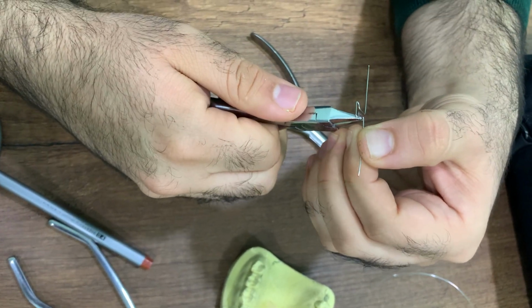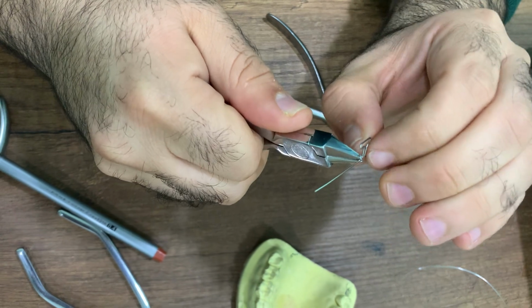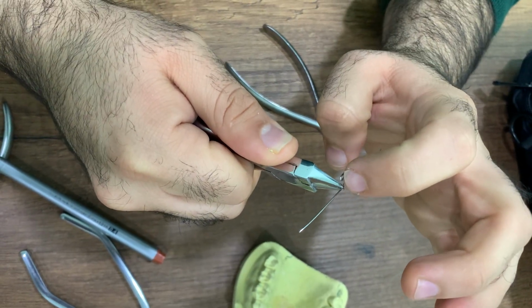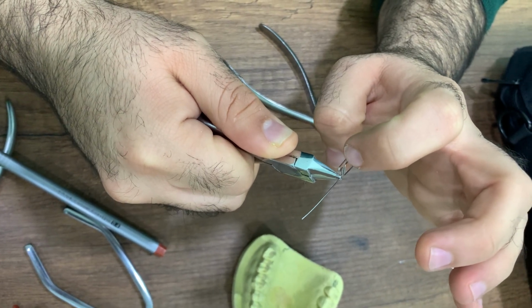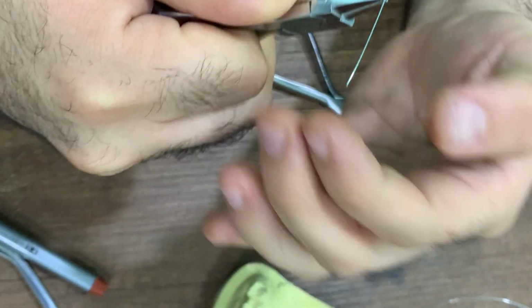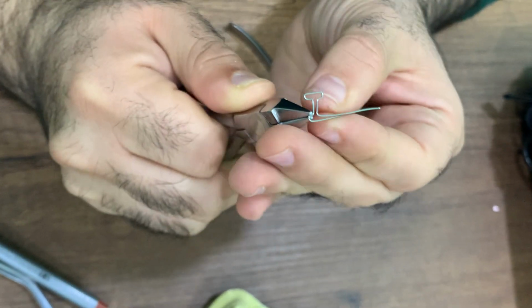Now we make two adjustment loops. The size of the adjustment loop should be smaller than or equal to the size of the loops of the active arm, like this.